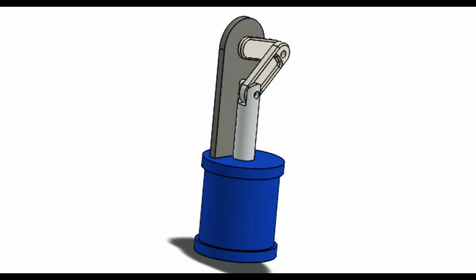which could be easily manufactured. So I have made a design in SolidWorks, as you can see shown below. It works on the same basic principle as the piston and crankshaft reciprocating mechanism present in our cars.